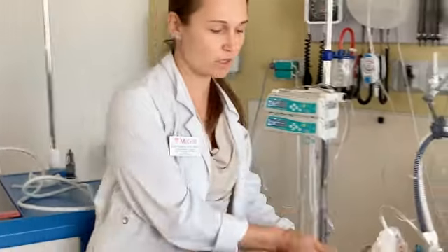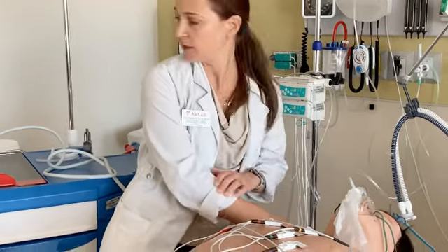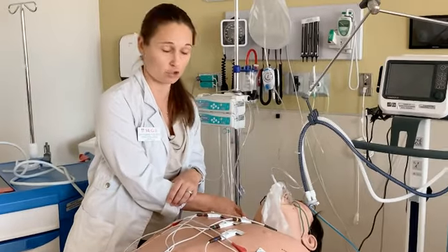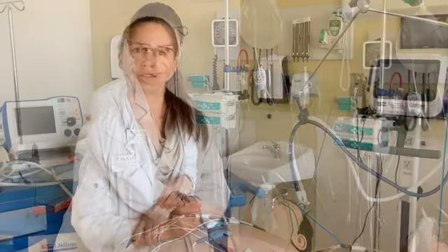So what I'm going to have to check next is the patient's pulse. I'll check, for example, the carotid pulse, and I'm pacing, let's say, at 60 beats per minute, so I need to make sure that I'm also feeling the carotid pulse at 60 beats per minute.